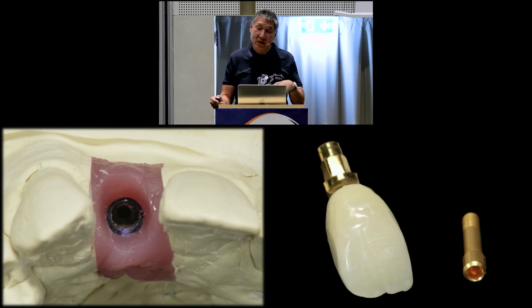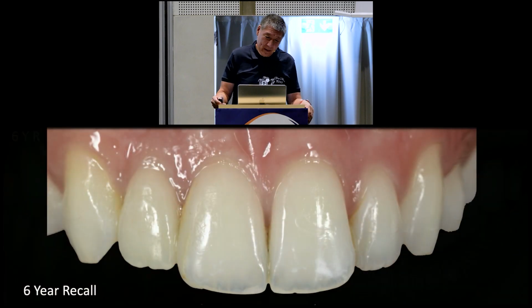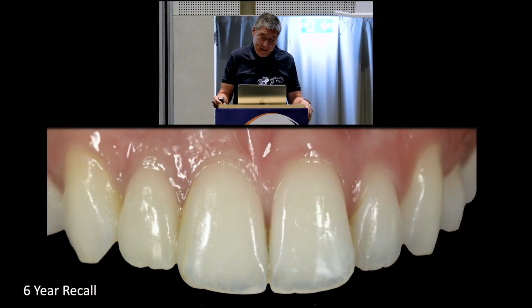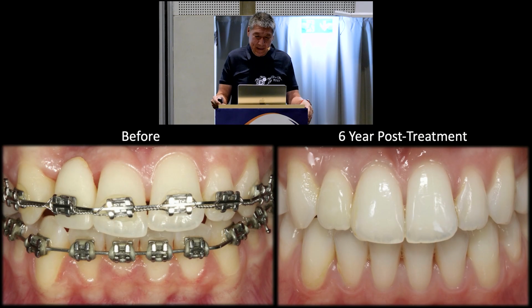And then when she came back, she had whitened her teeth. So we're guesstimating. It wasn't the most precise way of doing it, but that's because she has been going to school abroad, not in New York. So we're able to at least anticipate. And hopefully, I told her she'll get some rebounding of the whitening so that the color will match a little bit better in the end. Okay, so that's how we sequenced this one patient, a congenitally missing lateral incisor.